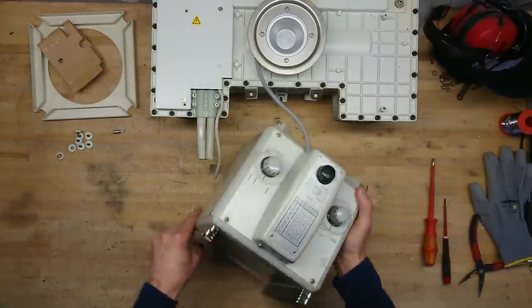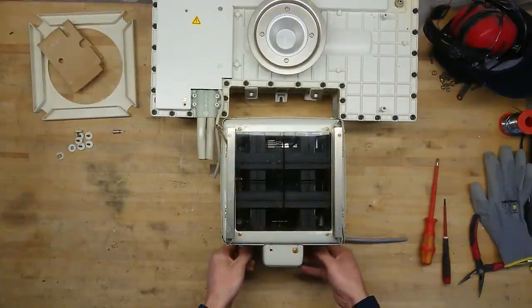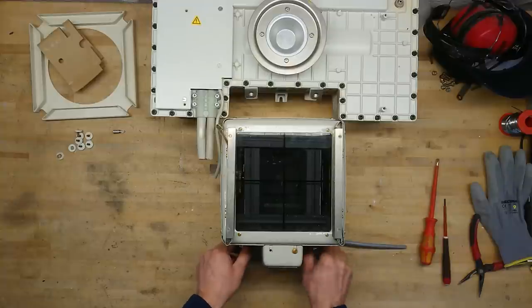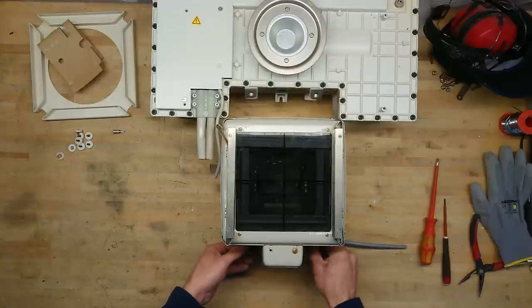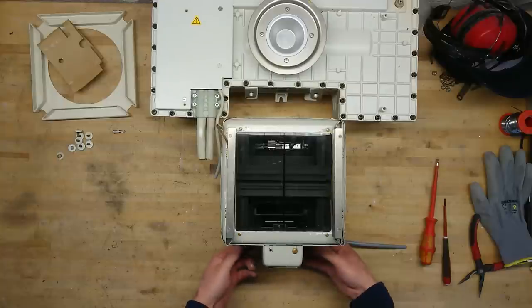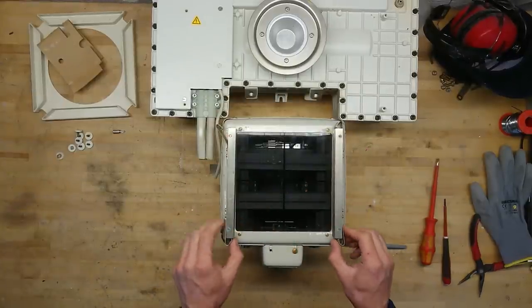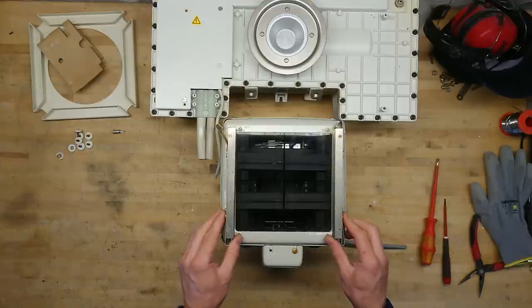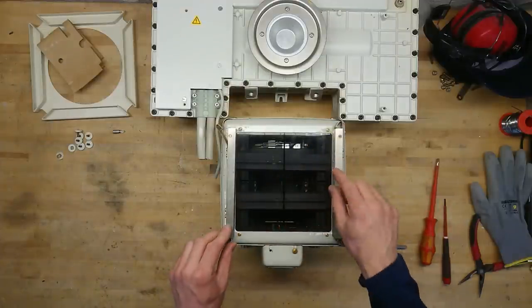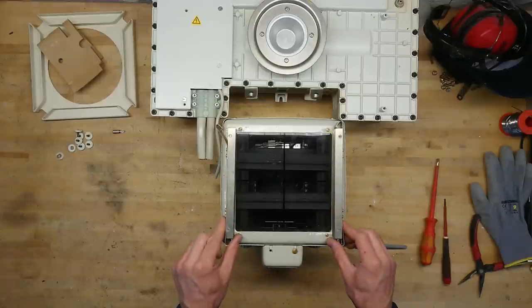Now, these dials move around the blinds in here, so that way you can shape the area at which the patient is radiated. You can also insert additional filtering here in these sliding slots. There are four slots for different filtering or shapes. I guess this very much depends on the kind of organ that you want to get a picture of.